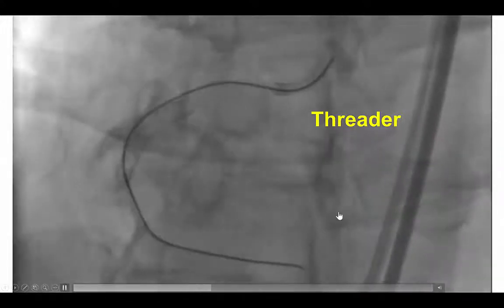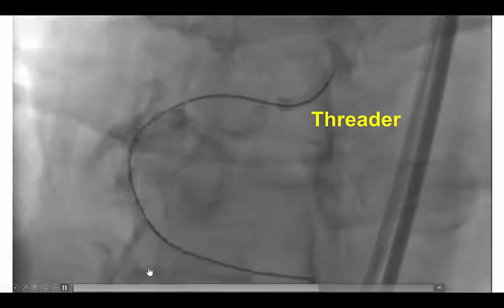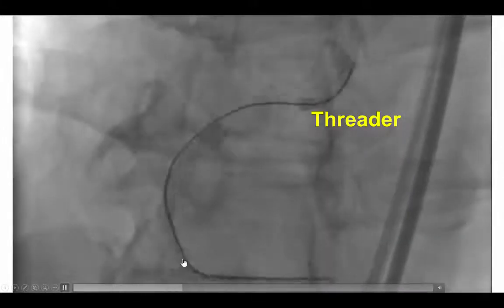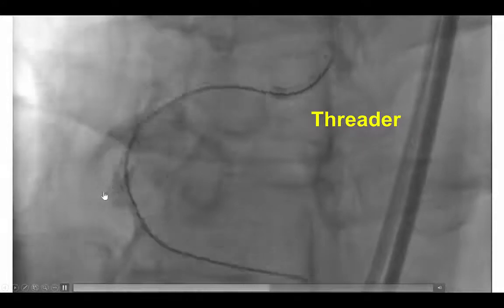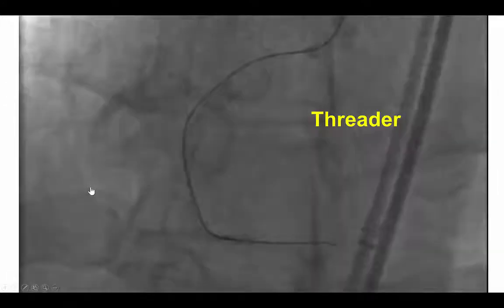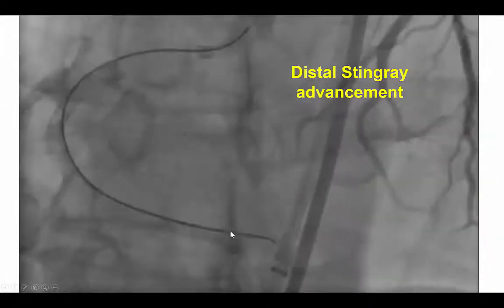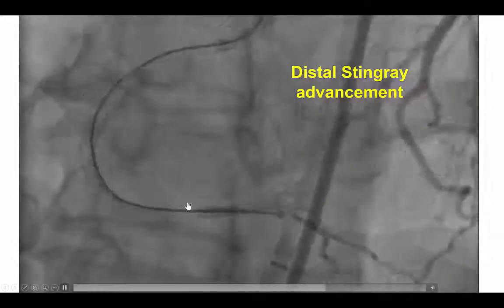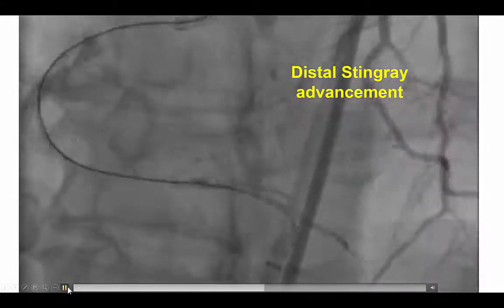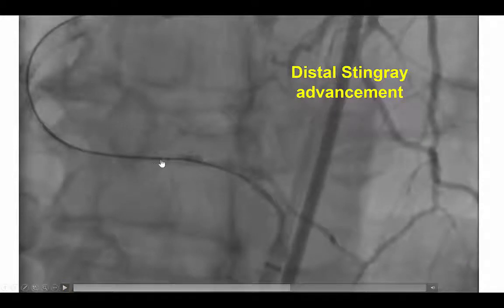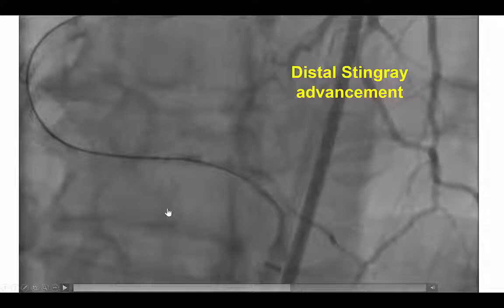This is a maneuver we want to avoid if possible because it can create hematoma distally, but in this particular case there was no way around it since we could not deliver the stingray balloon. After inflating the threader, we were then able to advance the stingray balloon all the way to the distal vessel, with the two dots of the stingray balloon located adjacent to the reconstituted distal vessel.